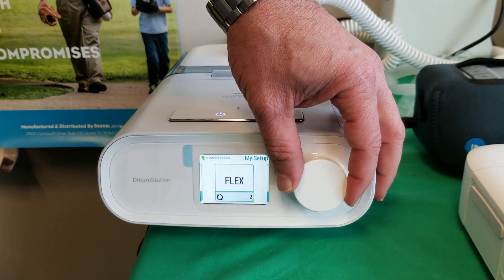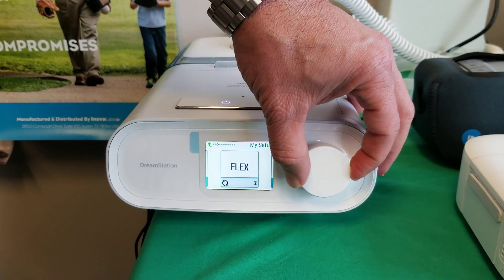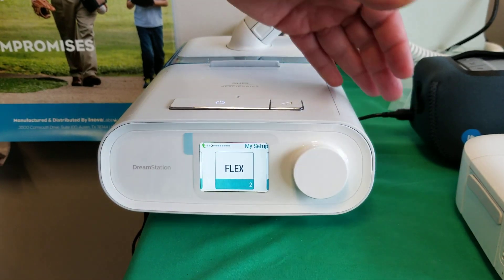So if you want to change it, you highlight it and change it to one and select it. If you want to change it back to two, you change it here and select it as well.